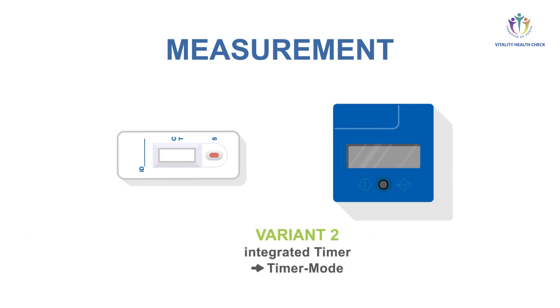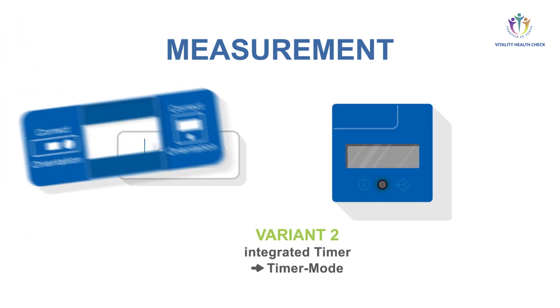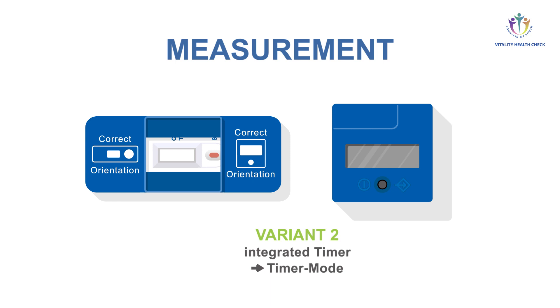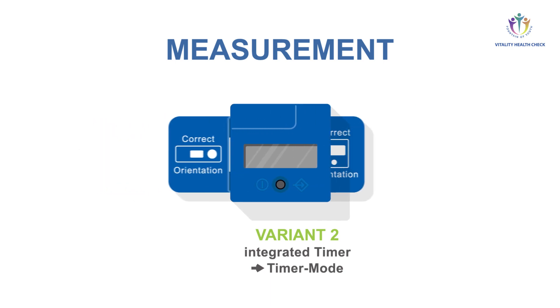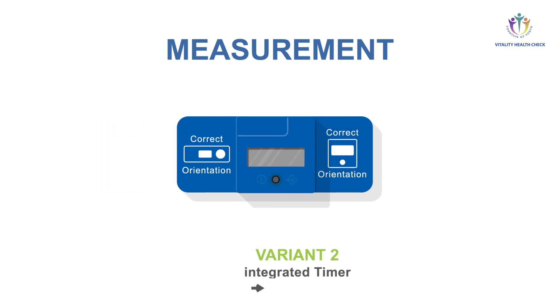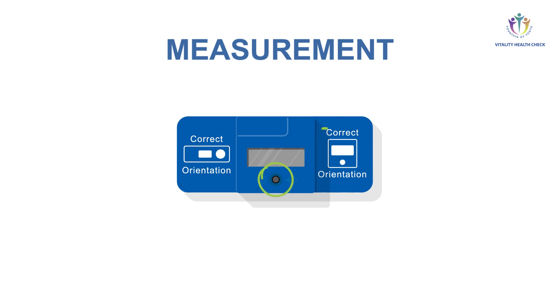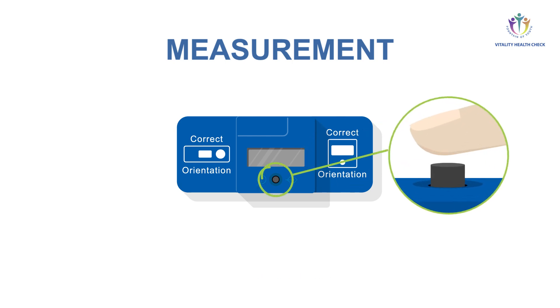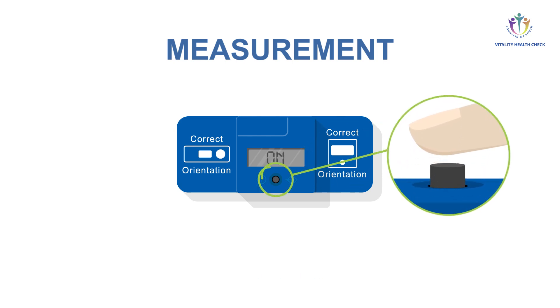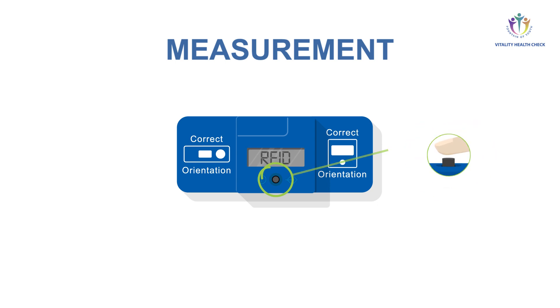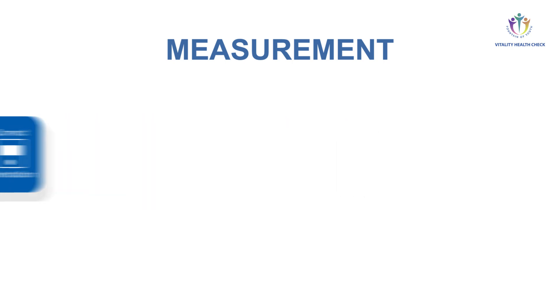For variant 2, timer mode of the VHC reader, place the adapter over the test cassette. Control for correct alignment according to the pictograms. Place the VHC reader in the right direction on top of the adapter. Turn it on by pressing the button shortly. After a self-test, the VHC reader shows on. Timer mode can now be activated by pressing the button long until the display switches and shows RFID.